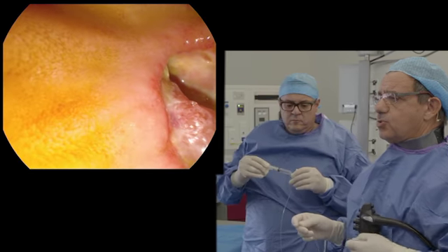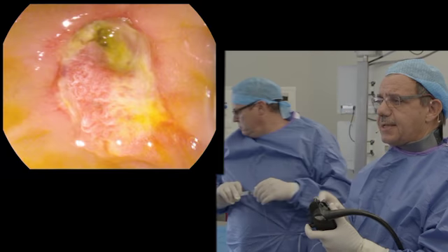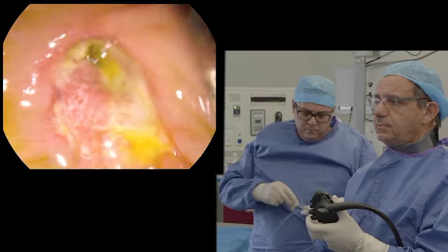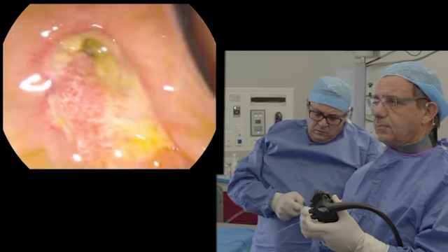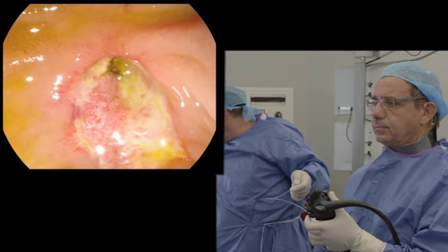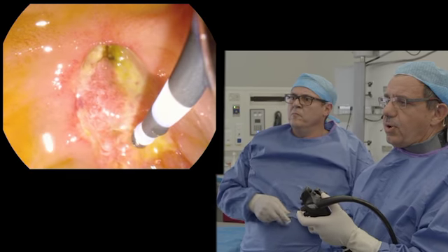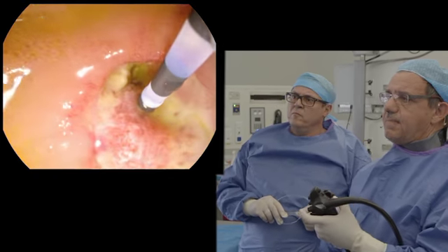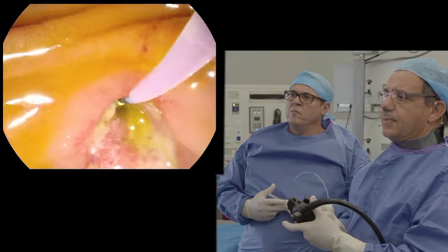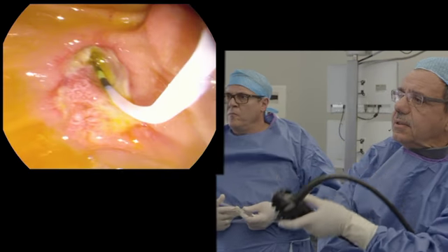Now the next step is to do a cholangiogram. I will use the ball tip catheter. You see here we have the pancreatic orifice, and this is the bile duct here. Okay. Now I will go into the bile duct. There is a stenosis here.